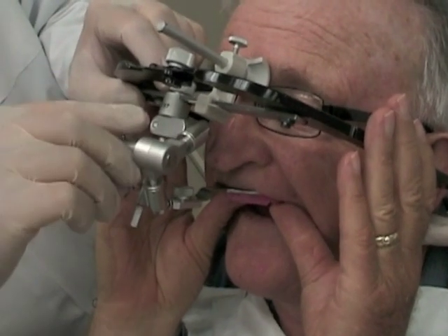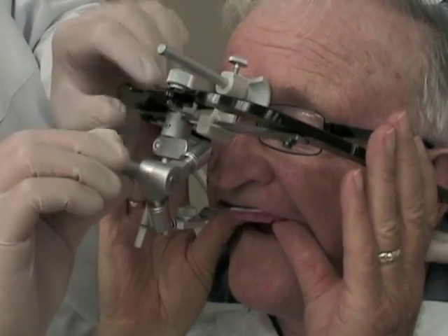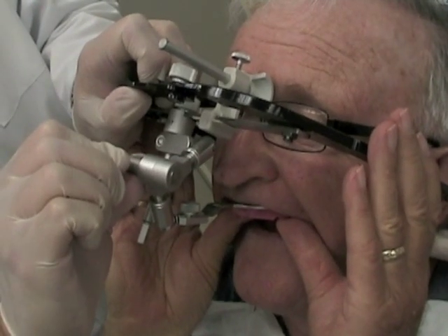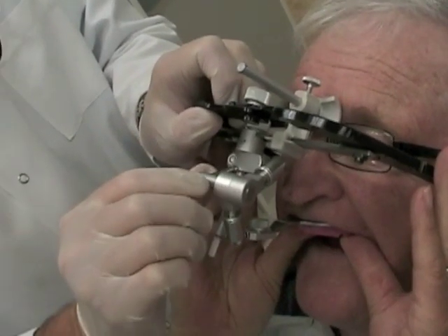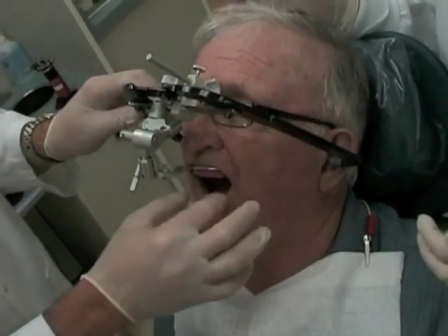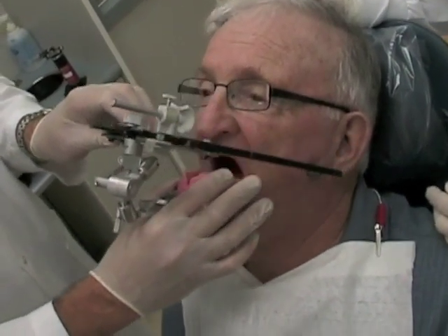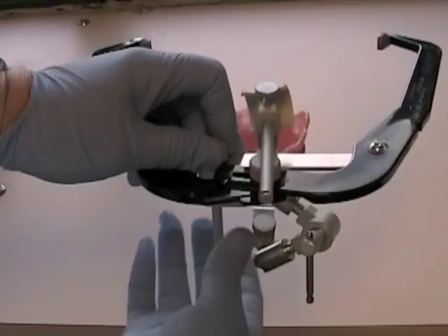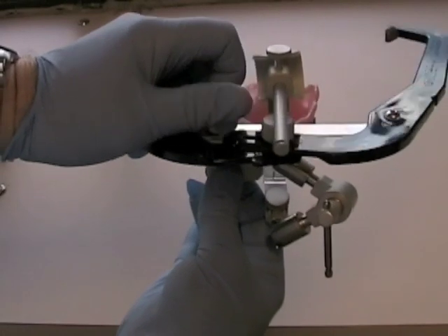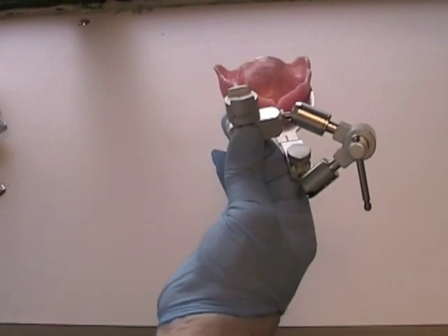Once everything is tightened and the orientation is confirmed, you can start to remove the face bow from the patient. To do this, release the central thumb screw in the center of the face bow, then remove the ear pieces from the ears. Release the pressure or suction from the record base and remove it from the patient, then remove the toggle assembly from the face bow. We are going to use an indirect mount, so place the face bow aside.